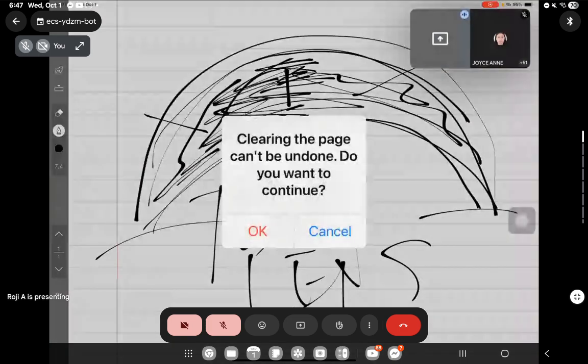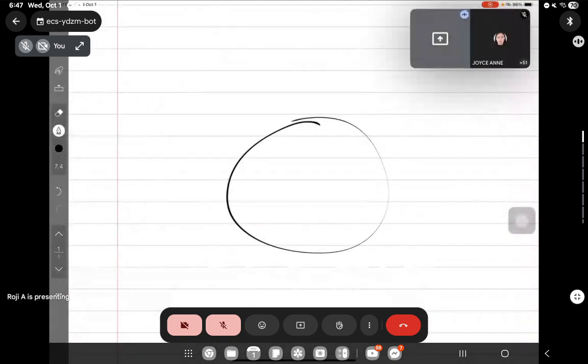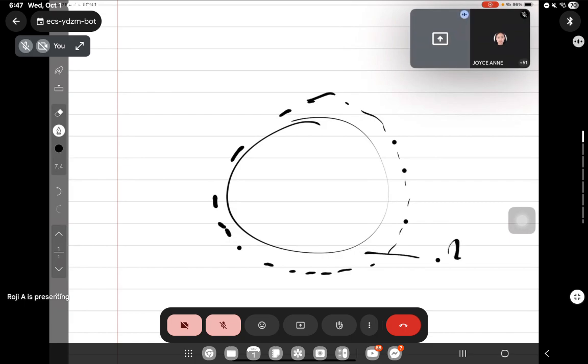All right. So if this is the cornea and this is the contact lens, a little decentration is accepted as long as it's 0.2 to 0.7 millimeters, correct?